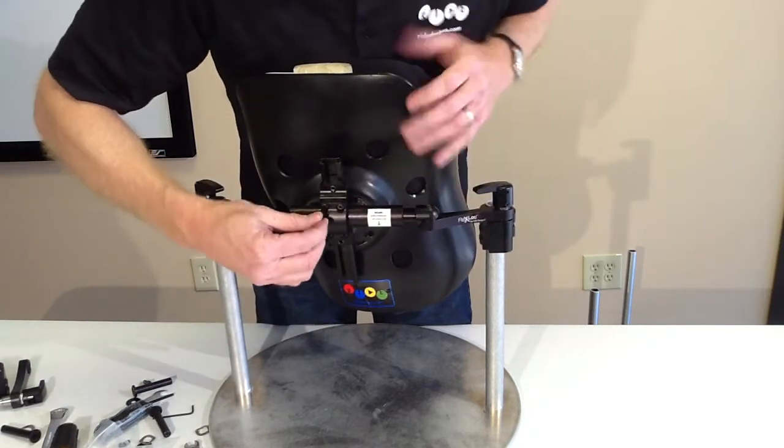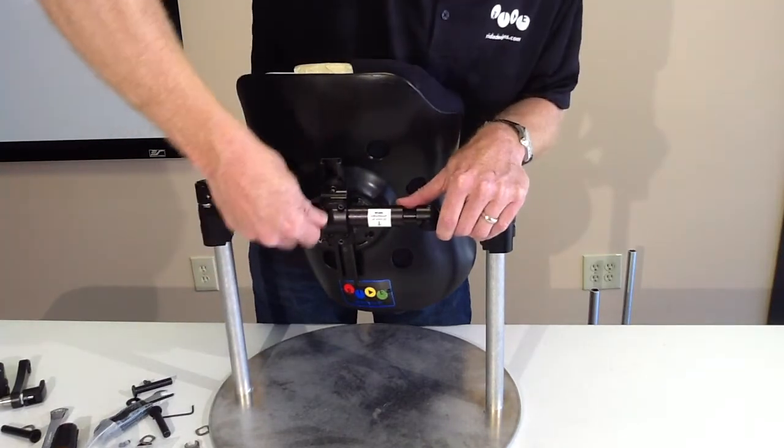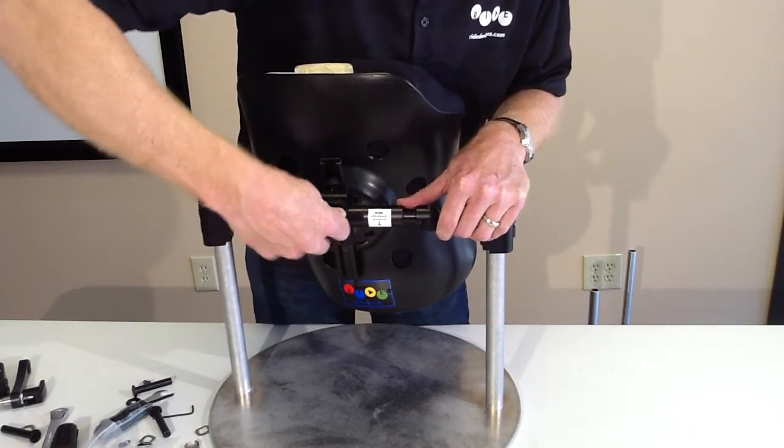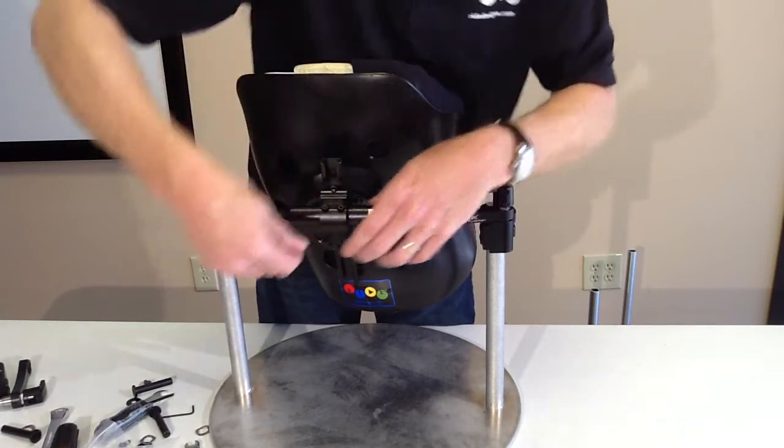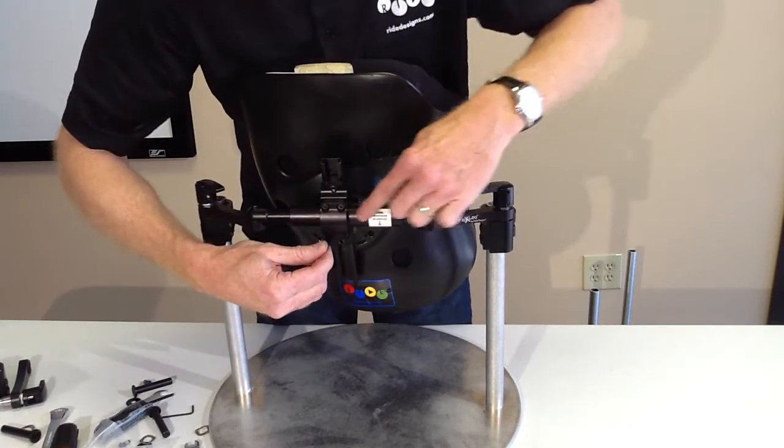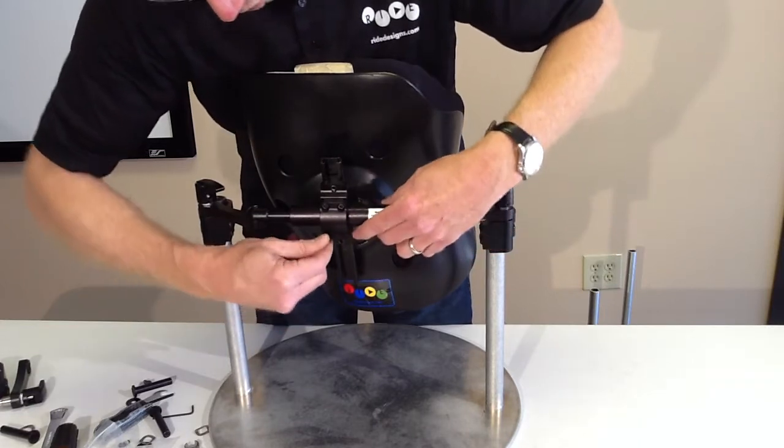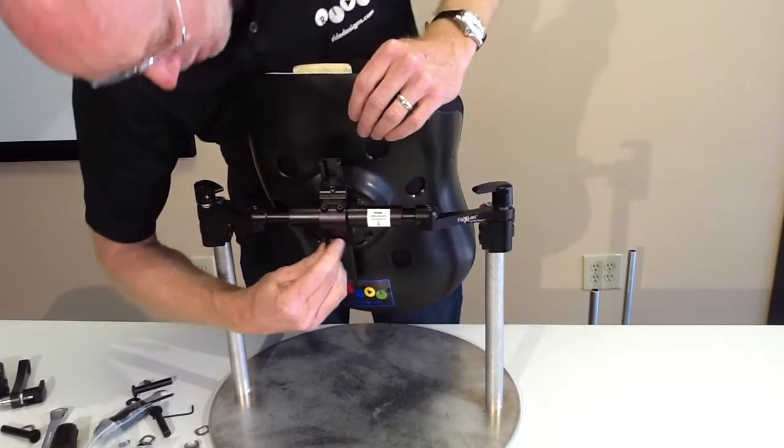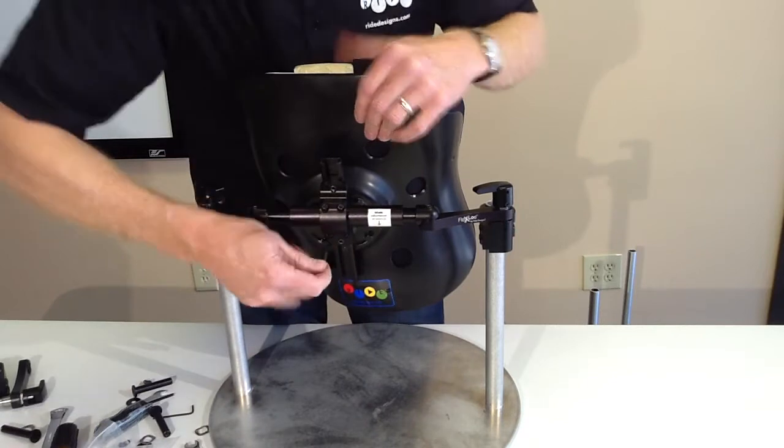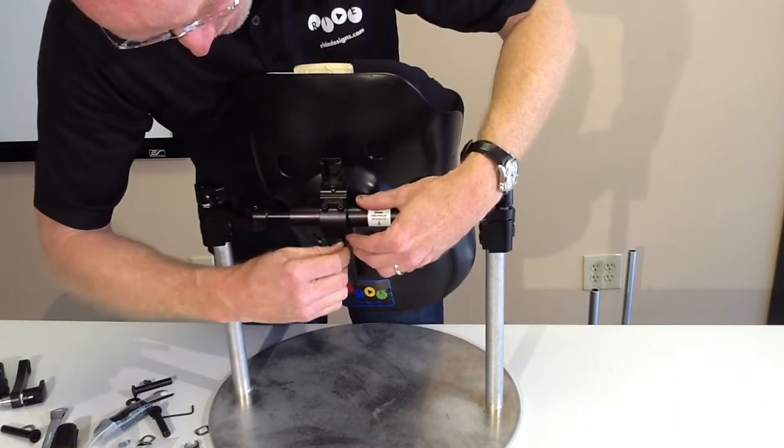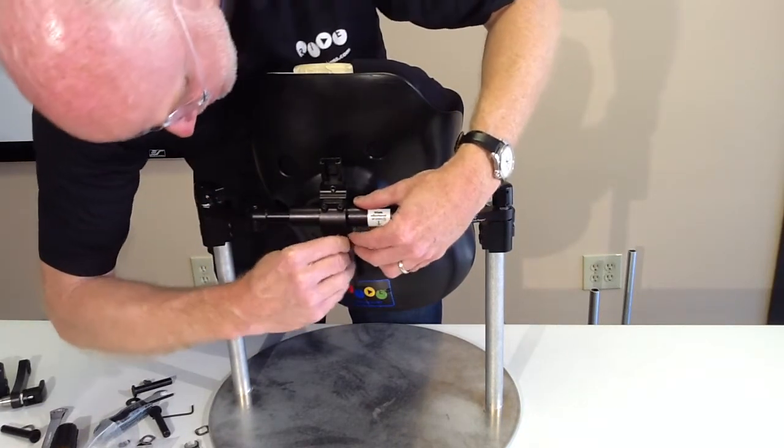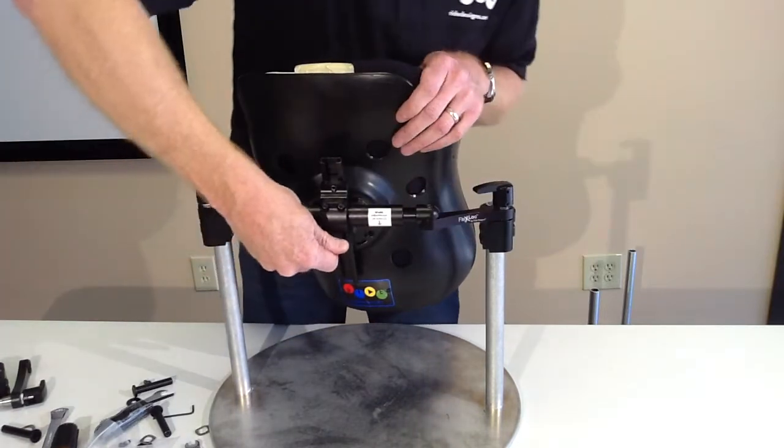Then I'm going to go to my back angle screws. Make sure I really lean on those because this clamp has teeth in it. It actually bites into this lateral tube, deforms it, and really locks that seat to back angle in. So you don't want to be light on those. Take your allen wrench and really lean on those.